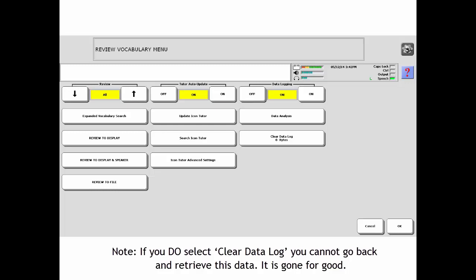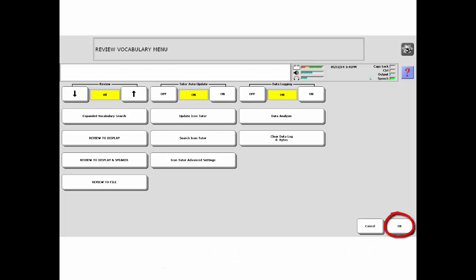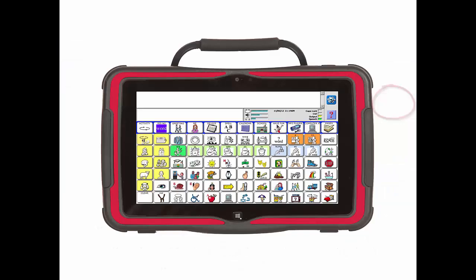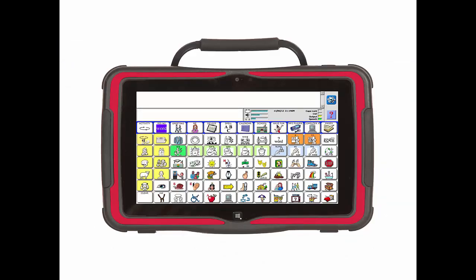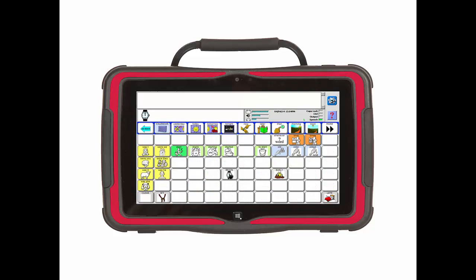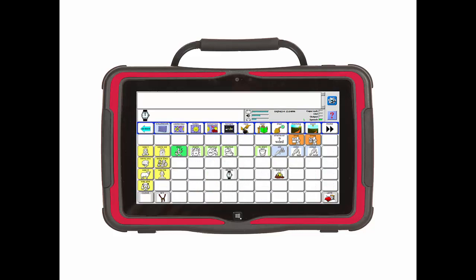The device is now set to collect data. Select OK and then go to Home. Now, when I say something, it will be recorded.